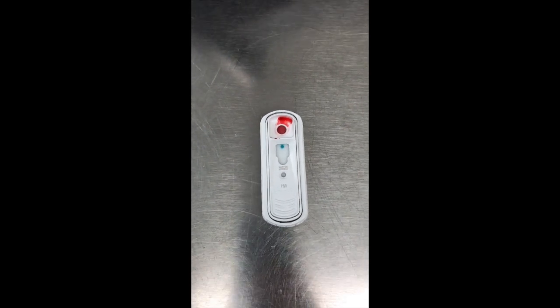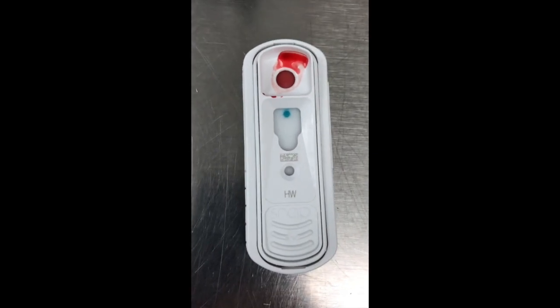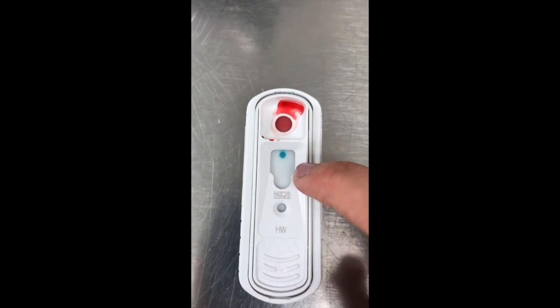Here are our heartworm test results after 8 minutes. As you can see, the test is negative. We have our control dot, and next to it, if the test was positive, there would be a blue dot to the right of this one.